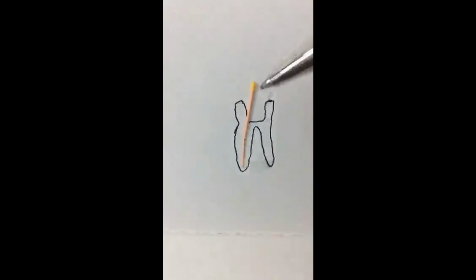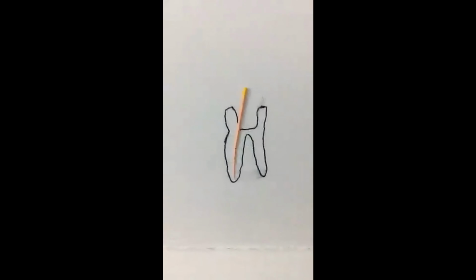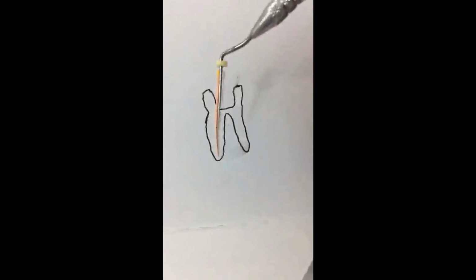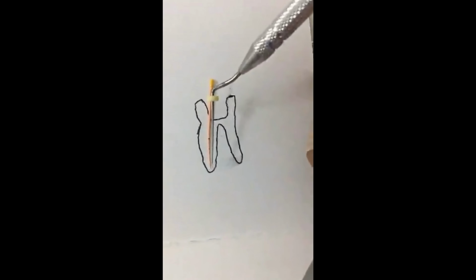Something I personally do is cut it at the level of the cusp with a scissor. It will be easier to insert your accessories. Always remember, the spreader has to go all the way up to 0 to 2 millimeters from the working length. Okay, sealer.